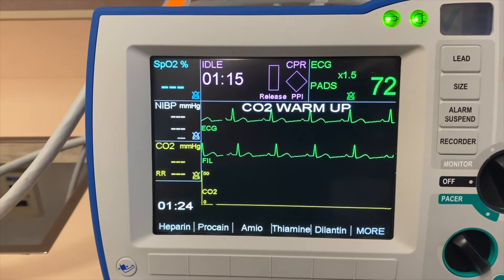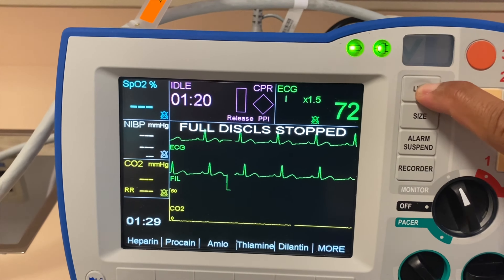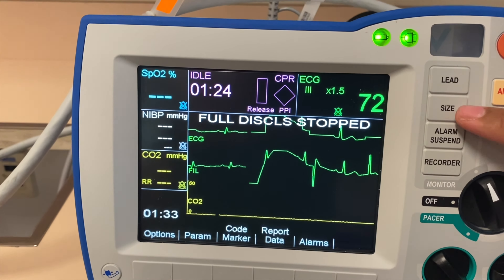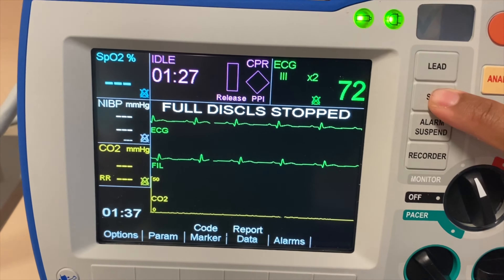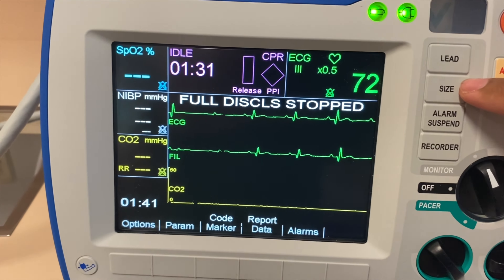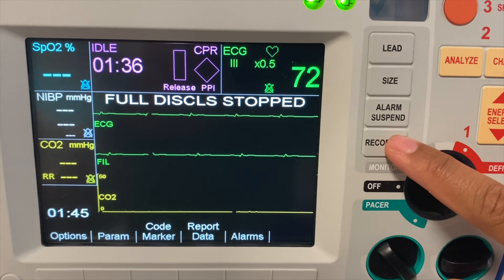On the side, you would see that you can actually change the lead to lead 1, 2, or 3. You can also increase the size by pressing the size soft key button here — times 2, times 3. And you can hit a continuous recorder if you press the recorder button here.